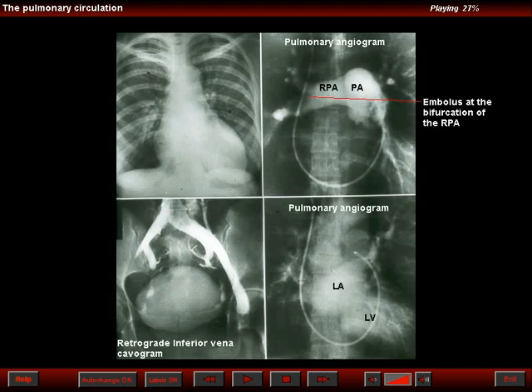The bottom left image is from a retrograde inferior vena cavogram. Note the reflux of contrast into the iliac veins, but the hypogastric vein, particularly on the right side, had a beaded appearance. In this way, we established the origin of the pulmonary embolus.